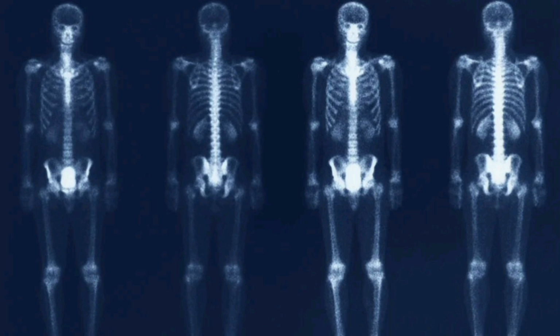Disadvantages. Radiation dose is equivalent to 63 chest X-rays. Non-specific.